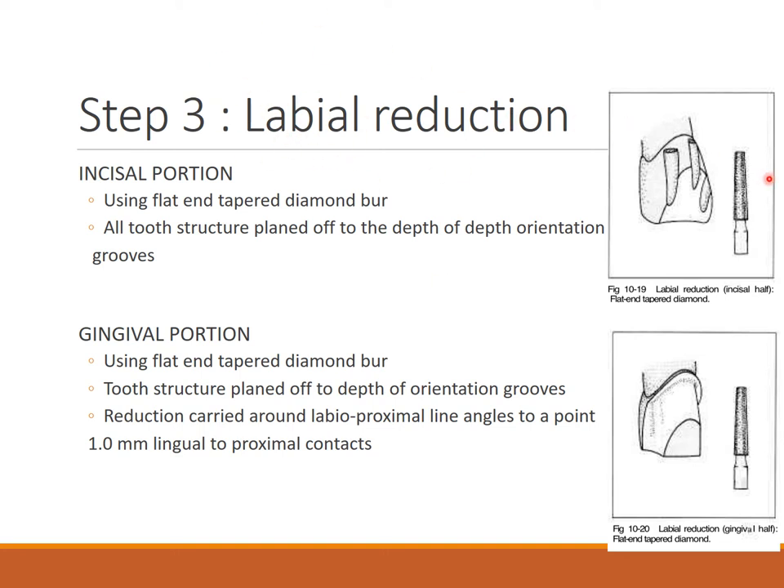Step three is labial reduction. Using a flat end tapered diamond burr, all tooth surface is planed off to the depth of the orientation grooves — first the incisal portion, then the gingival portion. The reduction is extended around the labial proximal line angles to 1.0 mm lingual to the proximal contacts.